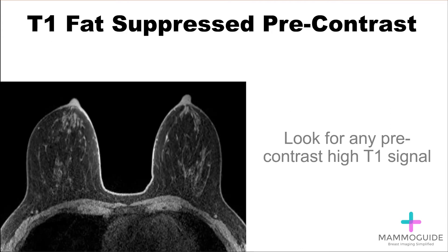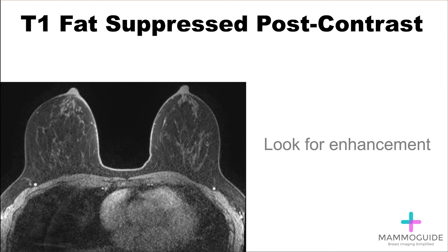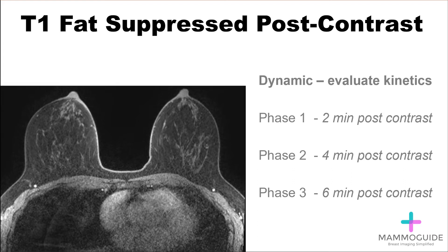The beginning of the dynamic contrast sequence is a T1 fat-suppressed pre-contrast image. On the pre-contrast images, you're evaluating anatomy and looking for any pre-contrast high T1 signal. After contrast administration, you're looking for enhancement — bright spots within the breast. Because it is a dynamic series, you can evaluate kinetics.